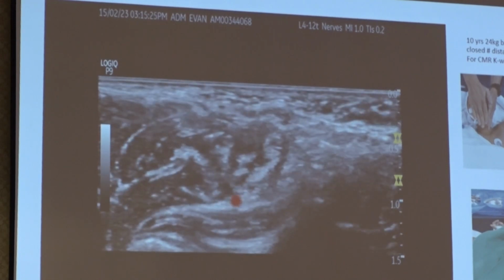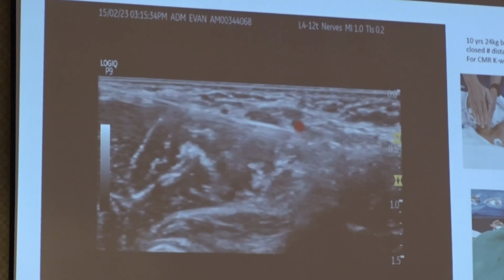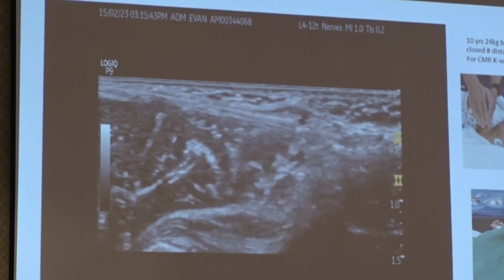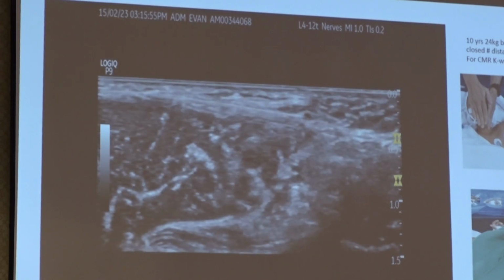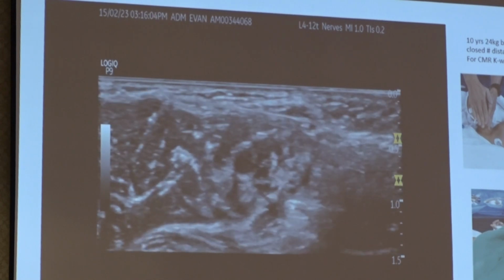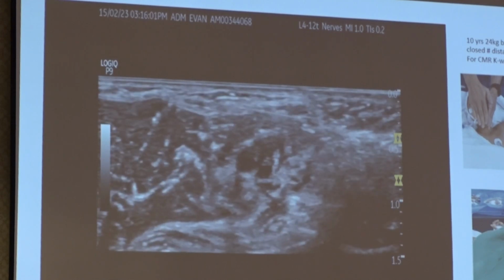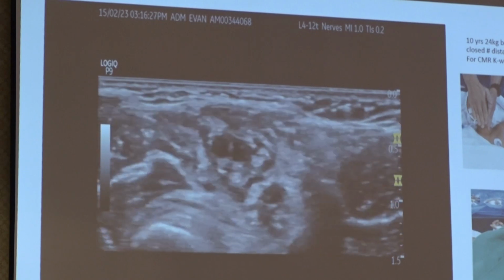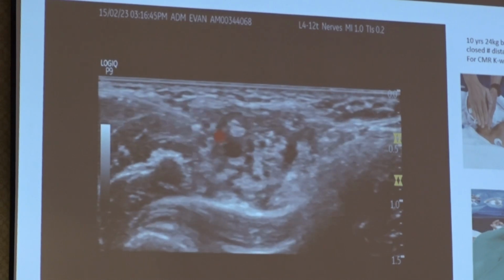You can see the radial nerve here, and this is the ulnar nerve. Now we're infiltrating around that: 4 mL here and 4 mL around the ulnar nerve. Every injection is a test dose. So we need to aspirate, and gradually and slowly inject the local anesthetic, and maintain pressure to occlude the numerous axillary veins. And then we proceed with the median nerve.